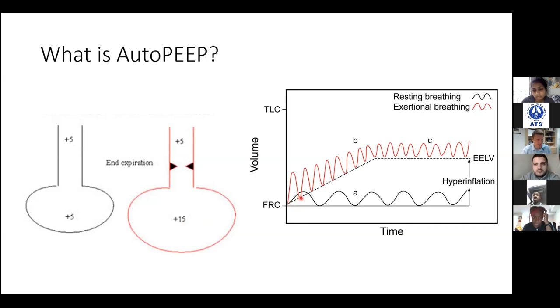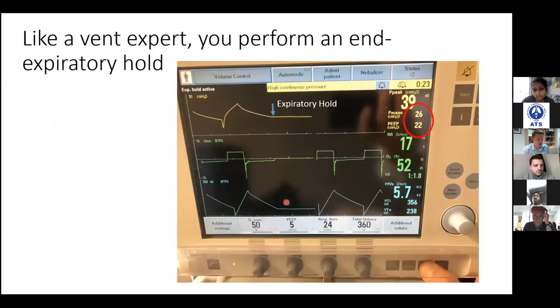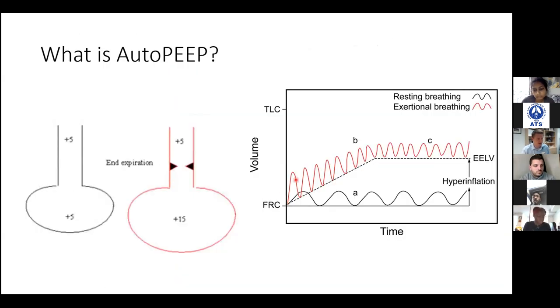And so you'll still be expiring. Look at this patient here. What's going on here? The ventilator triggered before this patient had a chance to finish expiring. They're still expiring out. And so what you see is that they get a full breath in, three quarters of a breath out before the ventilator triggers again because of the set rate that you put in. The next breath is driven in by the ventilator because it doesn't know any better. And the patient breathes out at a slow rate. It doesn't quite get all that breath out, breathes in.